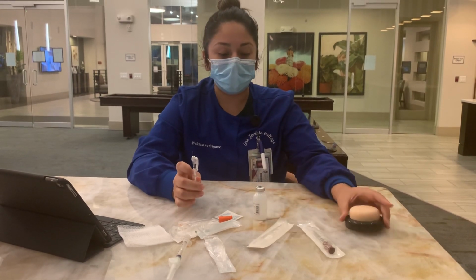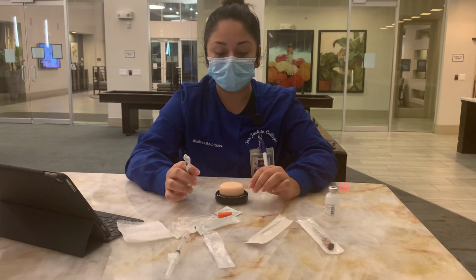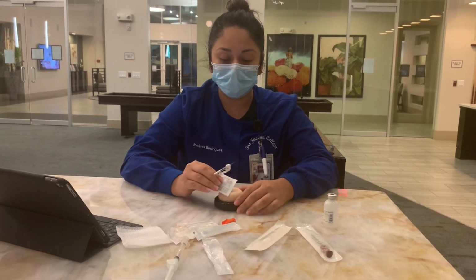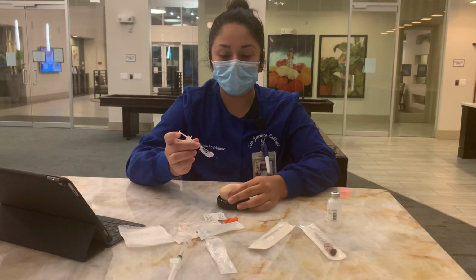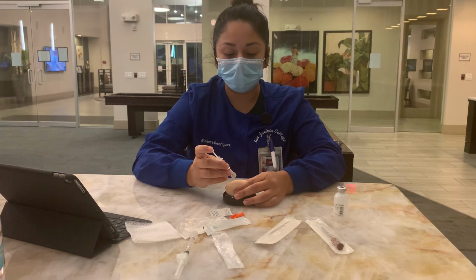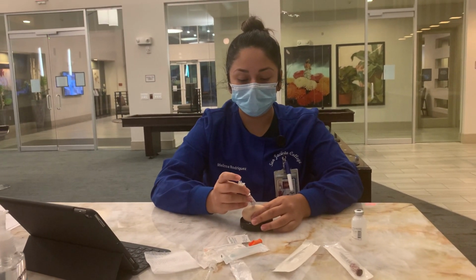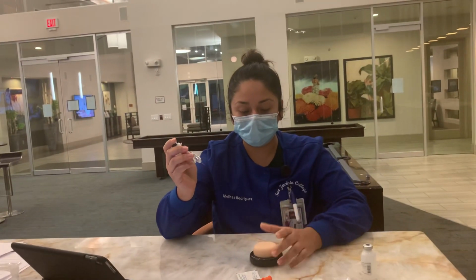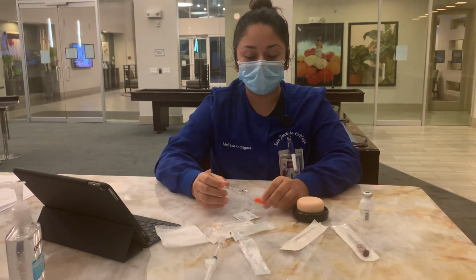I'm going to do the lower abdomen for my site. I'm going to clean my site, pinch, and go in at a 45-degree angle. Insert, draw the med, pull the needle out, and let go of the skin. Same thing, I'm gonna reassess after the medication is given.